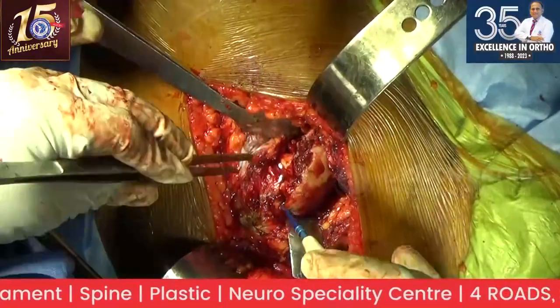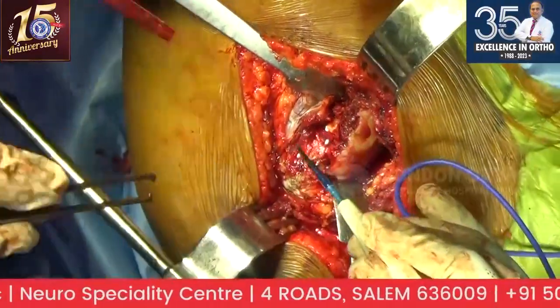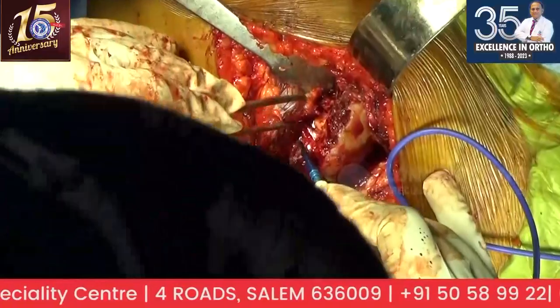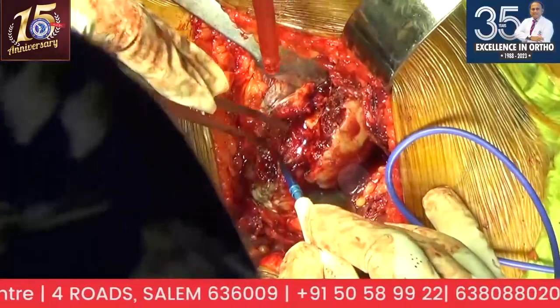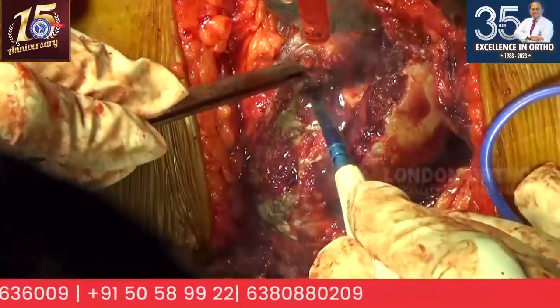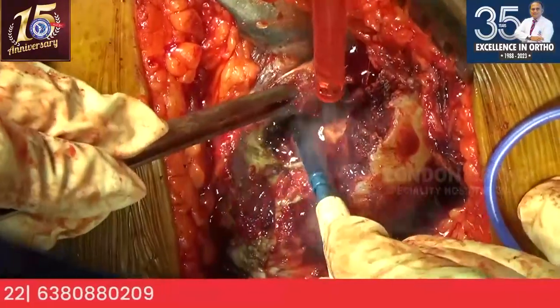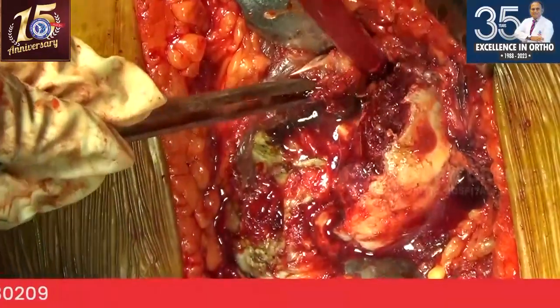You just start, you have to see it getting close, then only the gluteus medius, not minimus. Okay, so here I'm releasing a bit of the vastus lateralis in this particular case. Usually I don't need to do this. Cement pin.